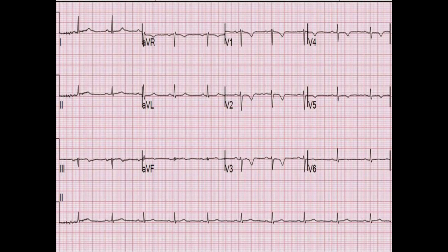So let's look at some 12 leads. And for R wave progression, we are looking at V1 through V6. We start negative and we end positive. That's a good thing. Well, where's our transition zone? V1, nope. V2 still haven't transitioned. V3 haven't transitioned. V4, hey, look at that. We're pretty equiphasic in V4. And then V5 is mostly positive. And then V6 completely positive. So V4 is our transition zone. This is normal R wave progression.